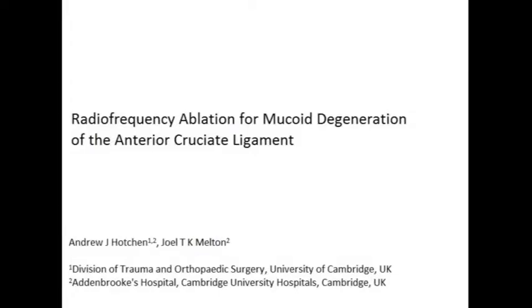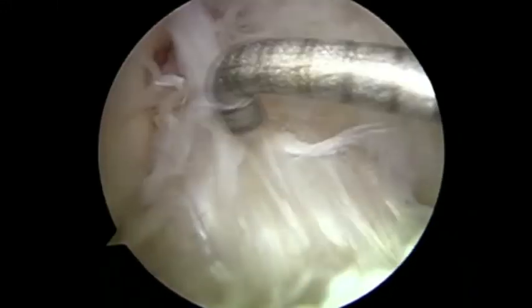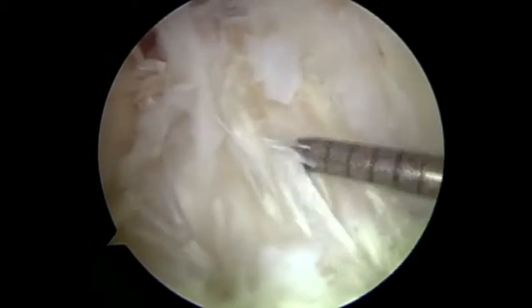Radio frequency ablation for mucoid degeneration of the anterior cruciate ligament. This is a video demonstrating diagnostic arthroscopy with debulking of the mucoid ACL using radiofrequency ablation.